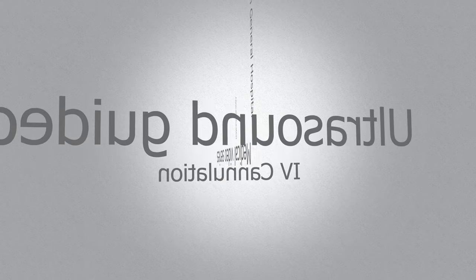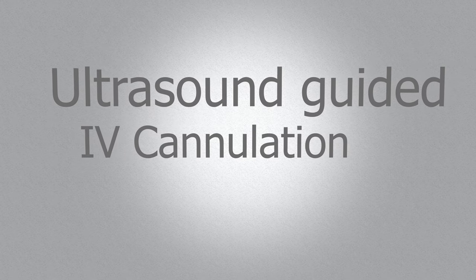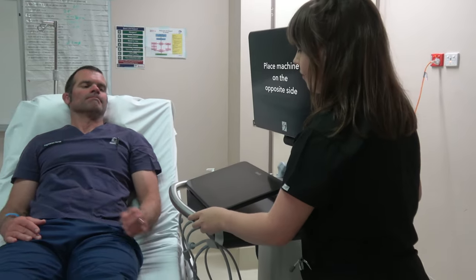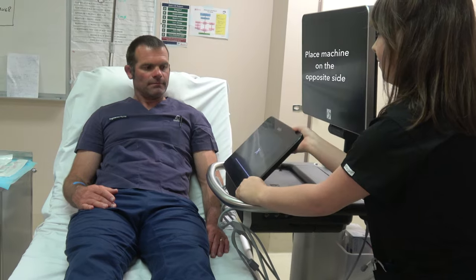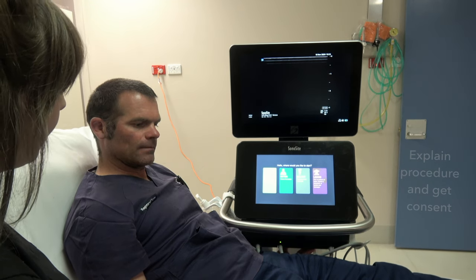Welcome. Let's learn how to cannulate using ultrasound. First, make sure the machine is plugged in. The machine is best set up on the side opposite to the arm being cannulated. Setting up yourself and the patient properly will make it easier for success.